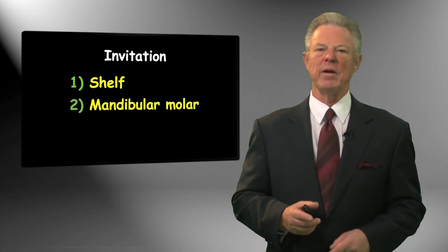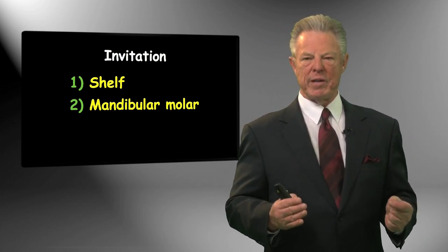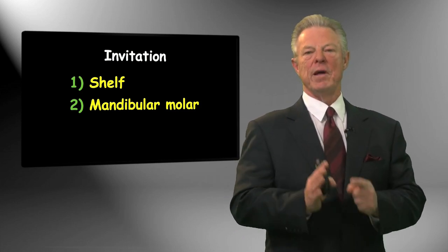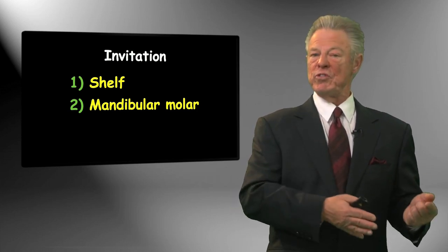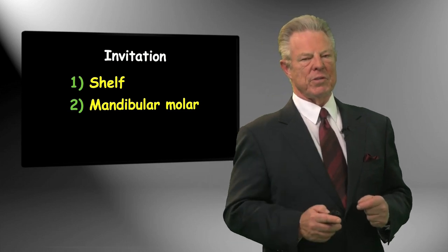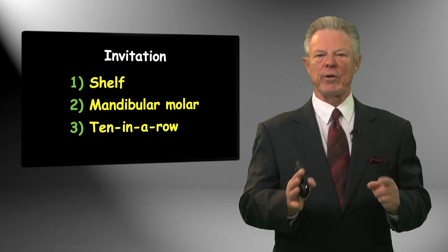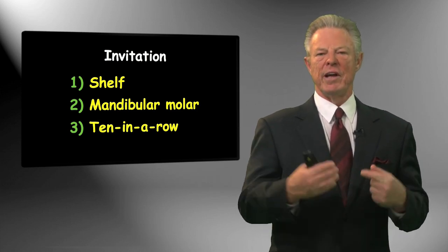Okay, so that's one way, one set of instruments. The second one, a little more valid, would be to take mandibular molars, 5 mandibular molars, mesial canals, shape one after the glide path with your current system, shape one with Next, and do 5 of them, and what was good and what wasn't good. The most valid way, and I wouldn't suggest you not do any of these, sometimes it's hard to get the extracted teeth, but a valid way to do this, and I've done this all my career, doing little mini studies, because the best education in the world is our own.